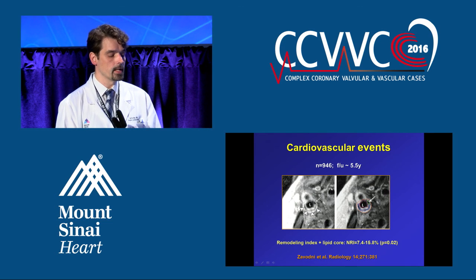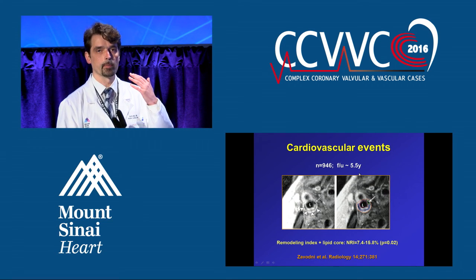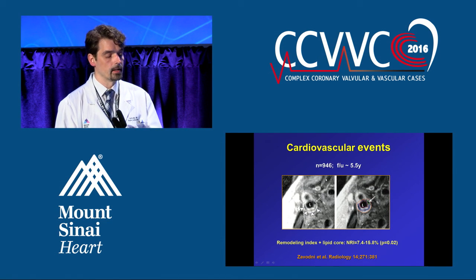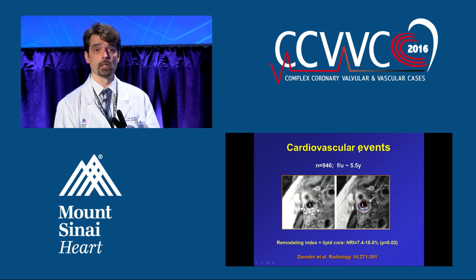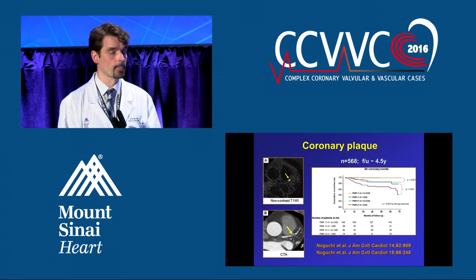And not only that, the MRI has also shown in one study that the presence of abnormalities, typically in the carotid arteries, where this is done, is associated also with cardiovascular events. Same thing as we saw with the ultrasound. So if you have a high-risk plaque in one territory, you're most likely also to have it in other territories. And in this particular case, it was the remodeling, when there is positive remodeling and when there was a lipid core. The combination of those two was a predictor of cardiovascular events.